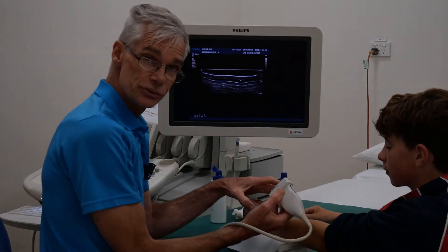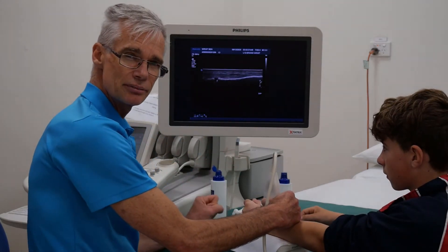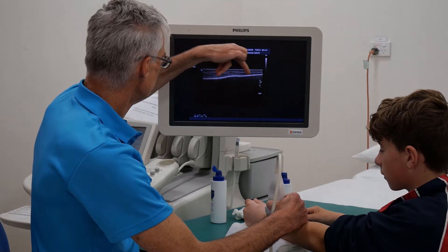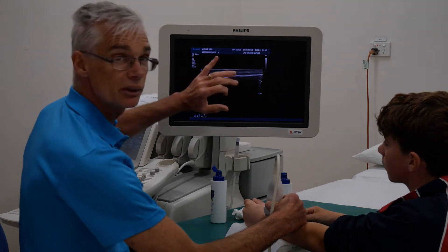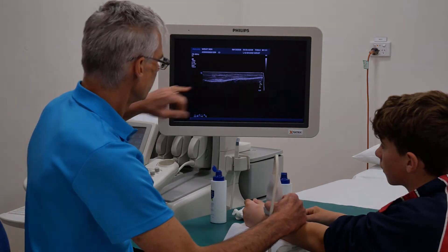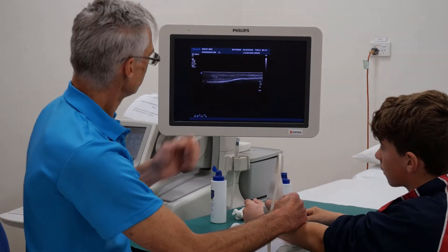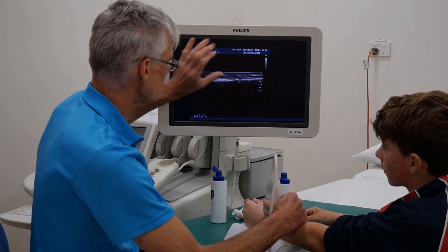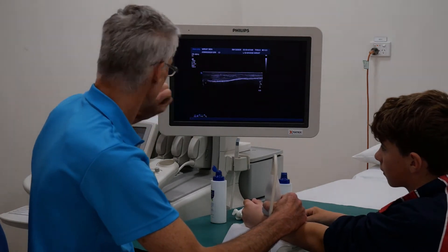Ben, I'm just going to put this on and of course you examine and feel for tenderness. Ultrasound is just part of your normal examination as it should be for nearly every musculoskeletal injury. It's very easy to see a bone — skin, muscle layer. Just remember anything underneath a bone is just reflection, so we don't really need that in the picture. It's a nice idea to minimize the amount of dead space at the bottom of the picture, whether you're looking at the abdomen, pregnancy, a DVT, a bone, or soft tissue — just get rid of the excess stuff for a clearer picture.